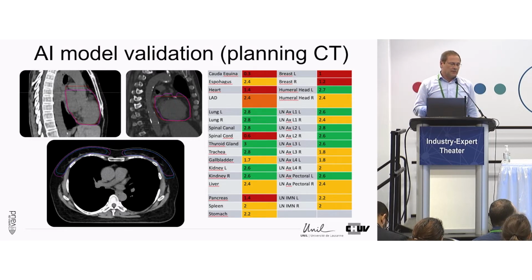And you see that there are some differences, but they are mainly related to the way the contouring is done in our department, and not really real differences. What we have validated is that we don't need to contour the organs for this kind of pathologies, and we can do that automatically with the tool. And this will be available in version 12A, if I remember well.